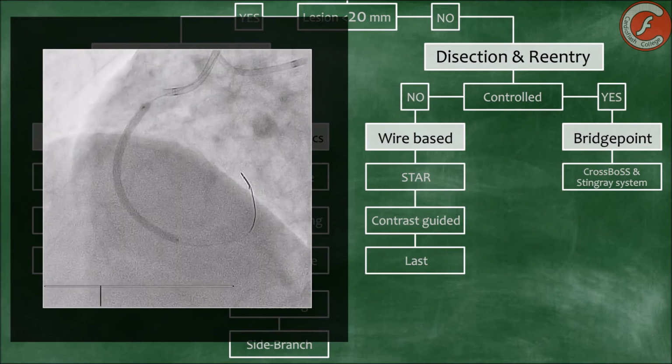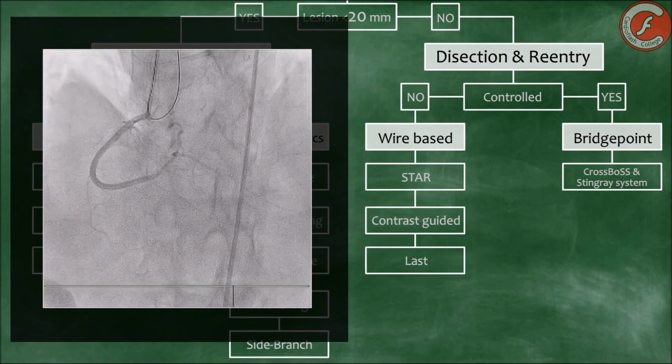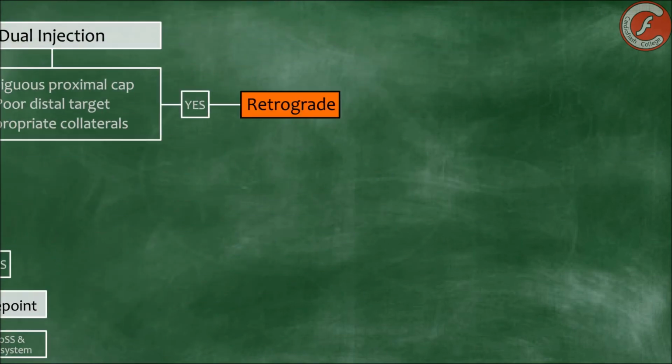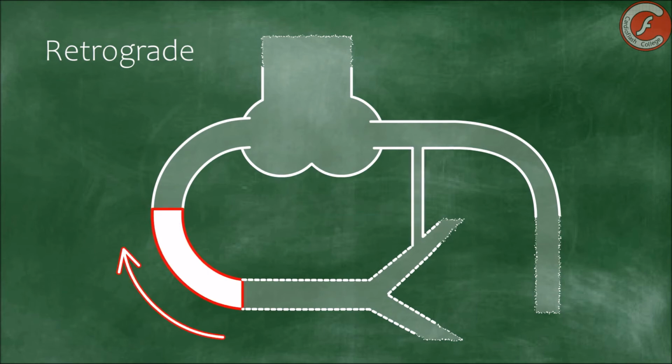However, what happens if we are not capable of antegradely reaching the distal bed of the vessel? Well, it means that we can use the right side of the algorithm, that is, the retrograde approach techniques. The retrograde approach techniques take advantage of the vessels of the collateral circulation as bridges to access the distal bed of the occlusion with the guide wire. Thereby, using different techniques of interventionism, coronary recanalization can be tried from the distal portion of the vessel.